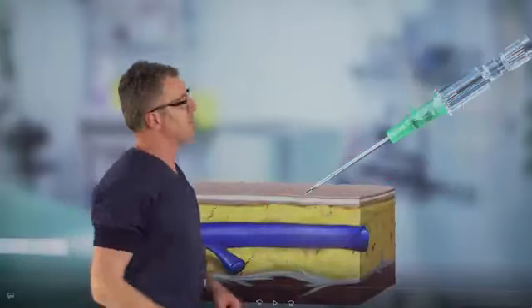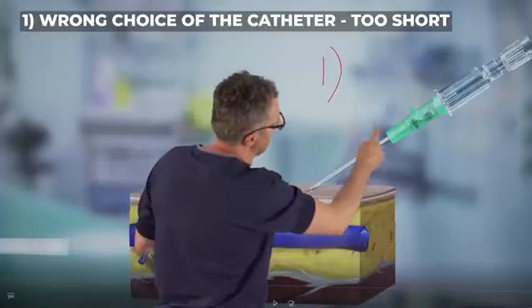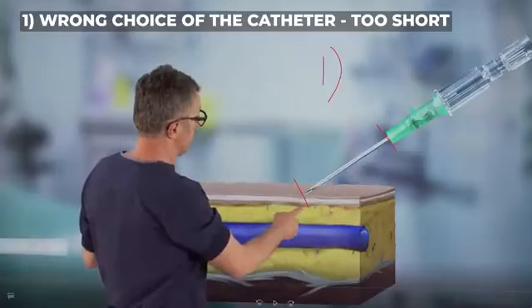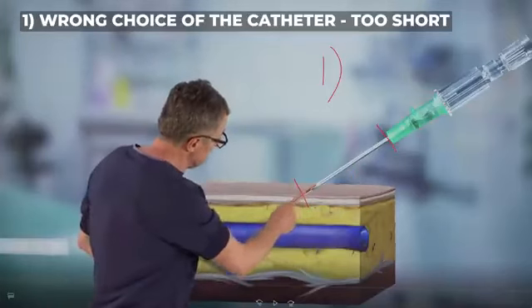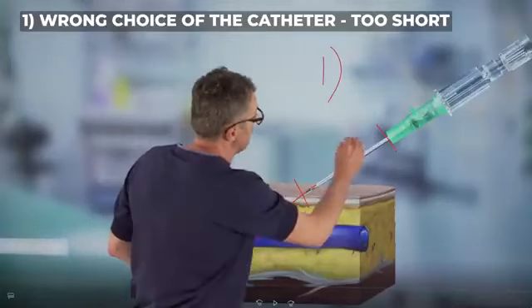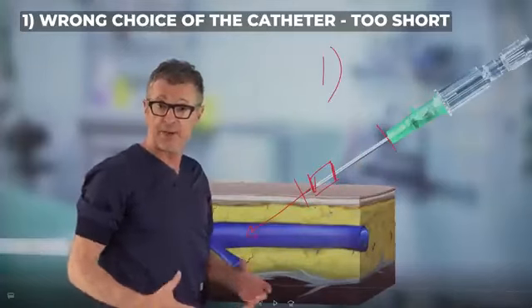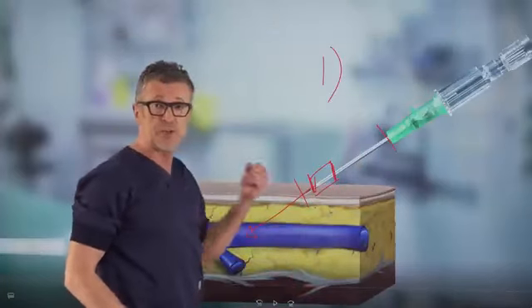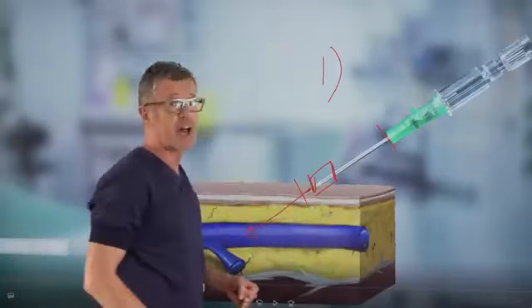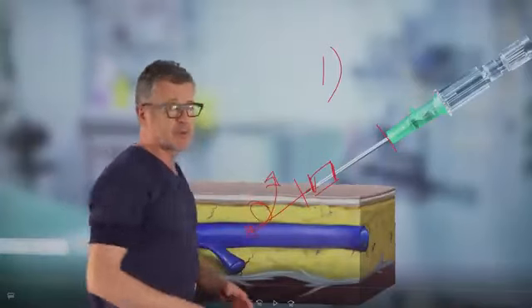So here's mistake number one. In this particular example, the catheter needle system is simply too short for the depth of the vein. In other words, once you advance the catheter and the needle and place it inside the vein, there will be very little of the catheter left inside the vein to make it stable. And as soon as the tissue moves or a patient bends the hand, or there's a little tug on the IV, the catheter tends to fall outside of the vein into the subcutaneous tissue.